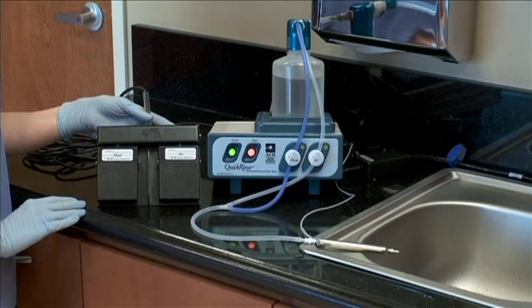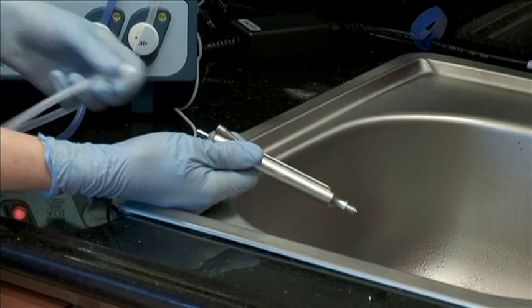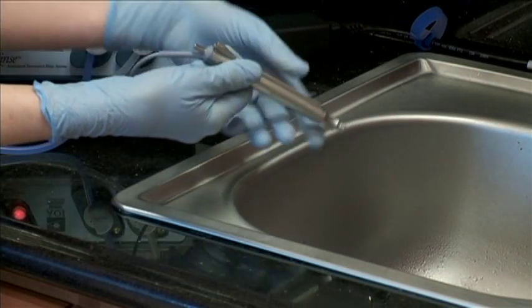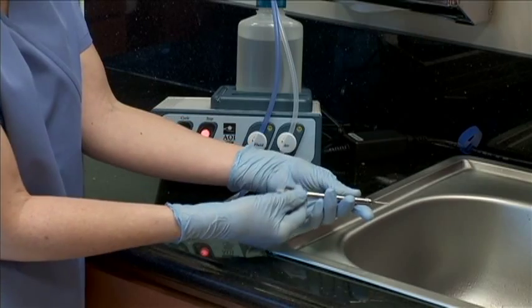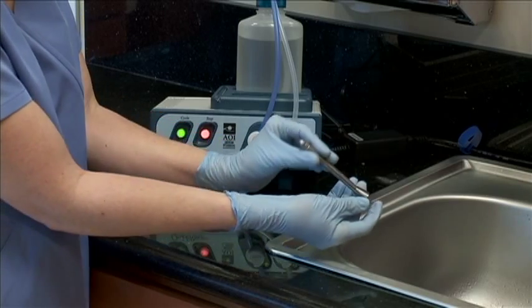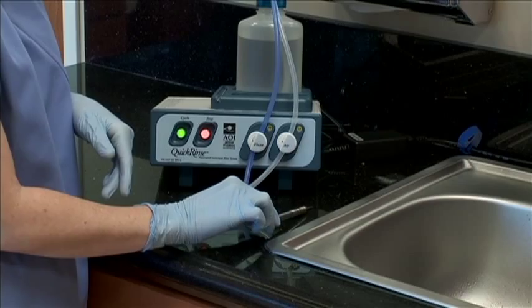Releasing the switch will turn off the pump and reset the unit. Now inspect the rinsed item for cleanliness before sending to autoclave. If you have more than one item to be rinsed, reconnect the instrument interface tubing to the next item or channel. The unit operation instructions are now complete.